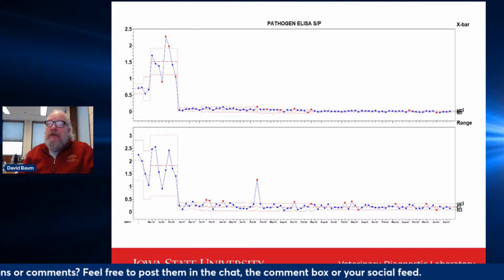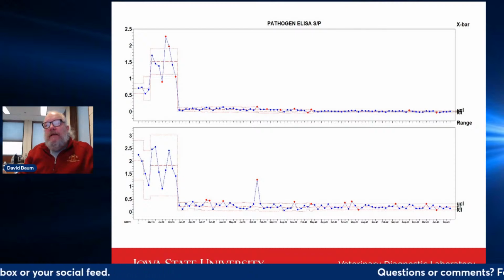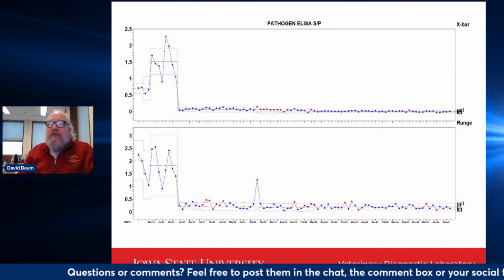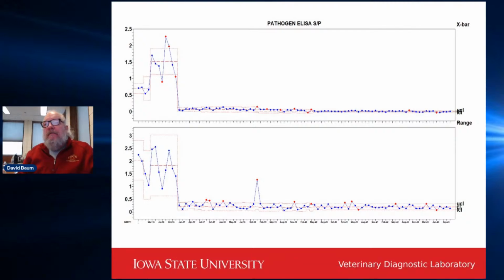But Dr. Baum, what about this dude up here? You know what? We get those on occasions where we get miscreant samples that just throw unusually loud results from an ELISA. In those instances, it does make sense for that sample to be retested immediately. But notice that even that value had no impact on the average S to P value at that sample. So my conclusion from this is that the population was repopulated with believed to be negative females in January of 2017 and has remained negative since that time, with the expected level of nonspecific reactors happening throughout this time.